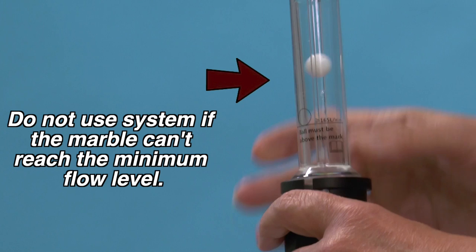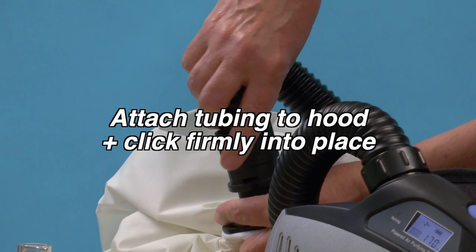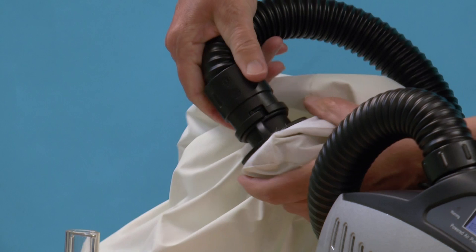Next, perform an airflow alarm test. Put your hand over the top of the tube and wait for around 15 seconds for the alarm to sound. If the alarm does not sound, do not use the system. Connect the tube to the respirator hood. Your Perso 3 respirator is now ready to use.